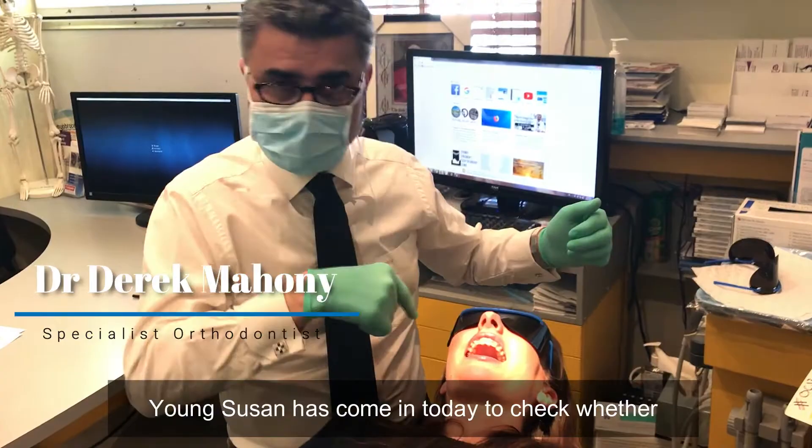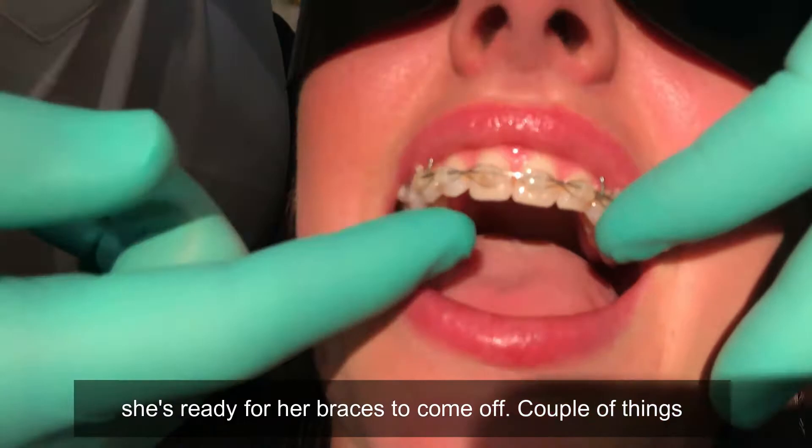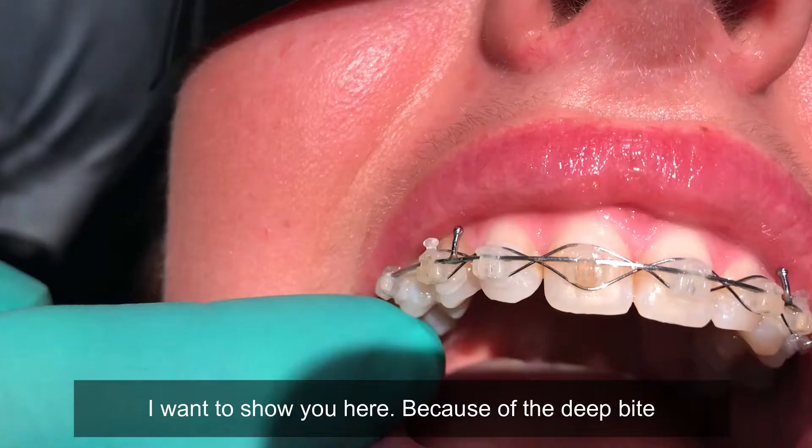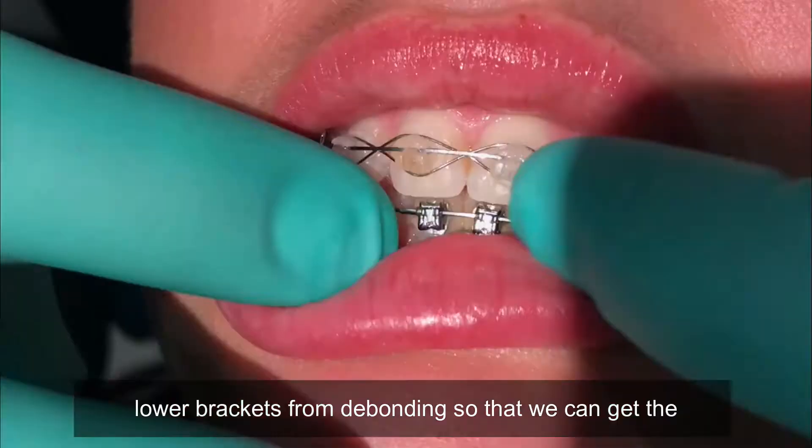I just want to talk about how we case finish. Young Susan has come in today to check whether she's ready for her braces to come off, and a couple of things I want to show you here. Because of the deep bite that Susan started with — if you look, just lift your chin up Susan — we have bite turbos, and the bite turbos protect the lower brackets from debonding so that we can get the ideal finishing.